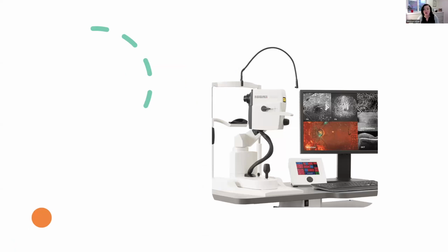As I said before, we get pictures of people's eyes all the time, in optometry and ophthalmology. If you've been to an eye doctor appointment recently, I'm sure you got pictures of your eyes taken. It's very common to have images taken using different techniques in the eye doctor's office all over the world. And it's run commonly in a primary care setting, and older adults who very commonly have neurodegenerative disease also need to get their eyes checked more frequently just because of natural eye changes that come with age.